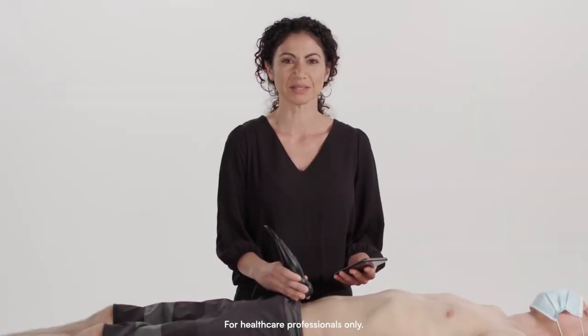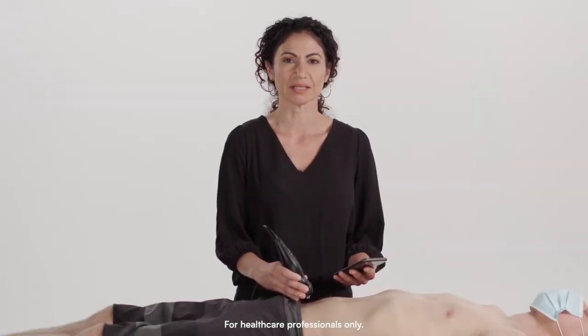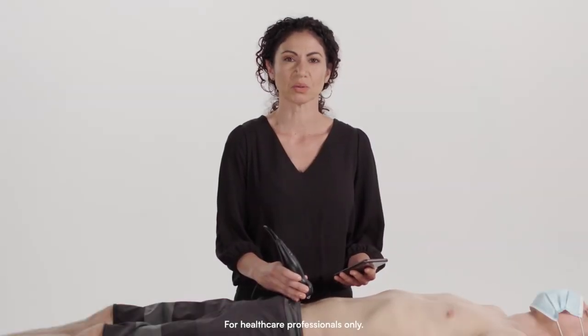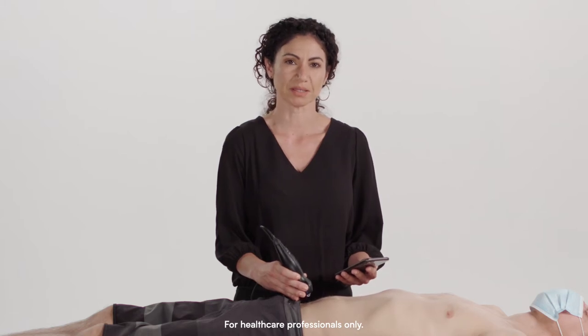I'm Teresa Lopez. I'm a Clinical Product Specialist at Butterfly, and today I'm going to show you a bladder scan with the Butterfly IQ+.